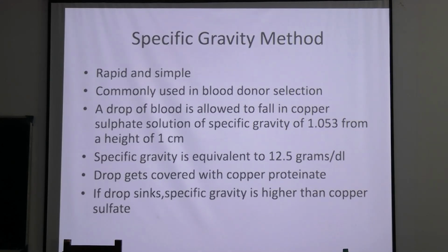Even now, when you go to far villages in the blood camps, this method is still used. So this method is to some extent relevant. This is the specific gravity method. This is the picture.